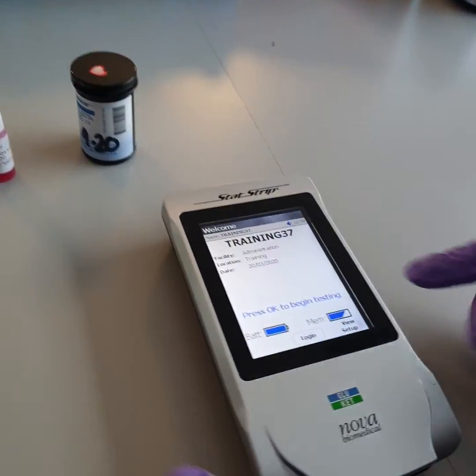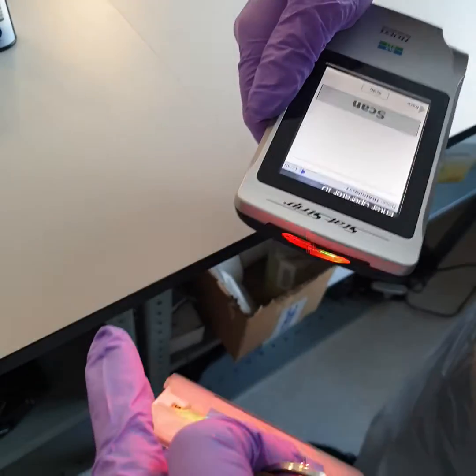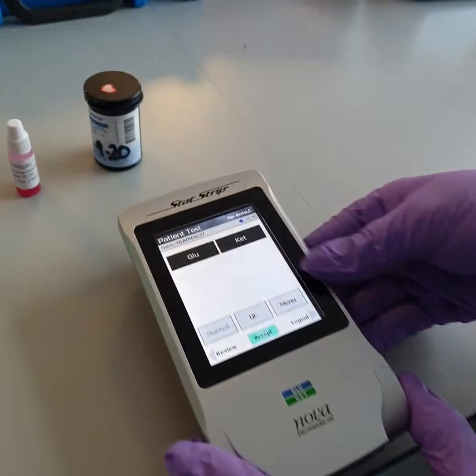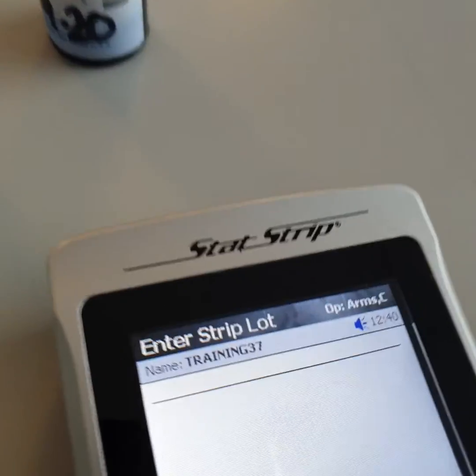You log in on the meter, click login and scan your barcode, then click accept. From this point, please follow the prompts on the top bar of the screen.